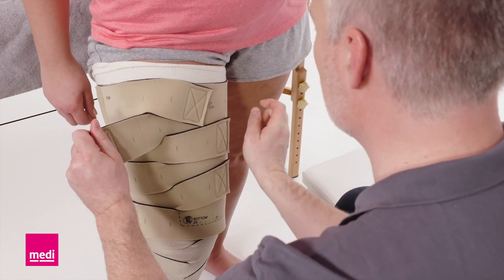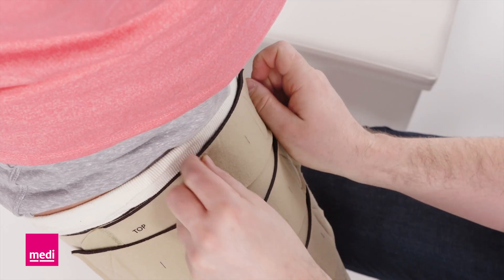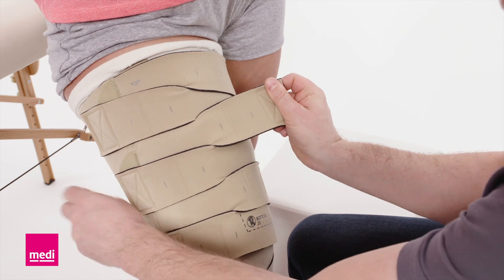Attach the bands alternately from bottom to top so that the garment lays flat and wrinkle-free. Slightly pull the upper band upwards to avoid wrinkles. Hold the top of the garment while attaching the last band. If there are gaps or creases, simply readjust the bands.